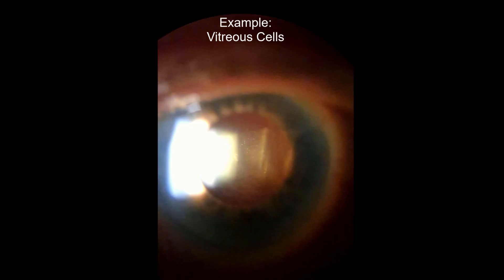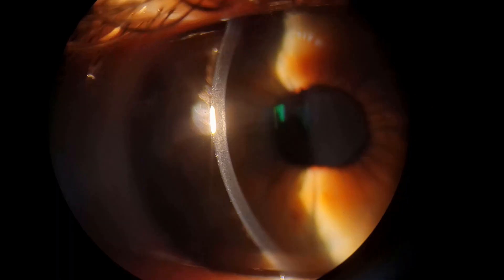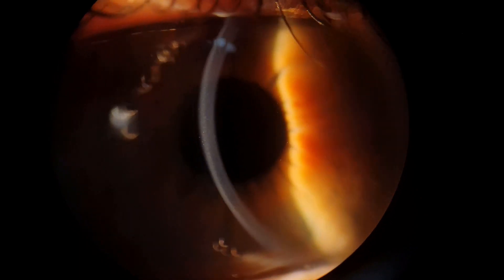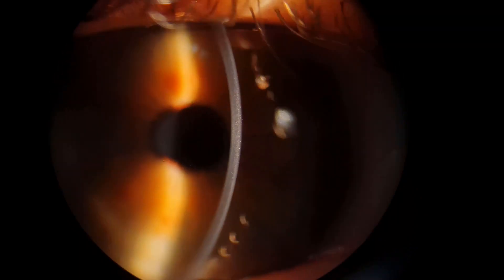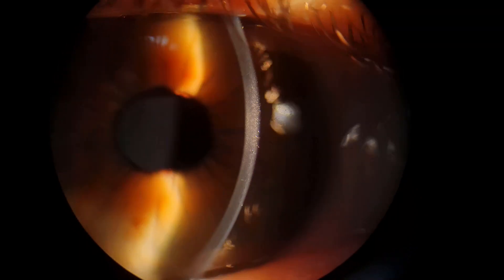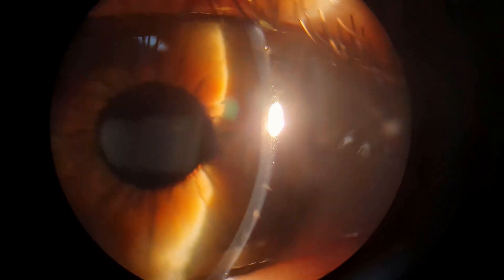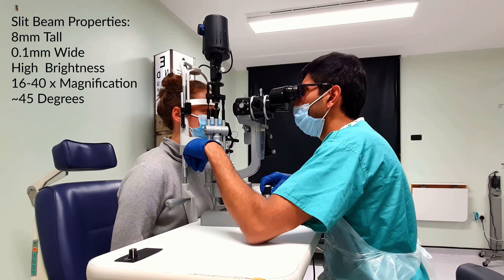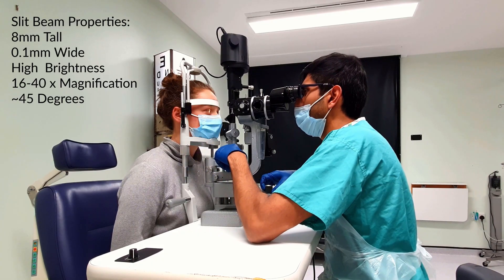If you use a thin narrow beam you can produce an optical section. This technique can help you to assess semi-transparent structures such as the cornea or lens. For this you should use a tall thin beam with high brightness intensity. Move the illumination arm to around 45 degrees and adjust appropriately.